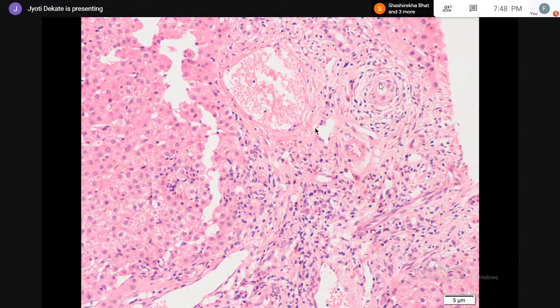We can see that this bile duct is infiltrated by some of the inflammatory cells, and also striking is this concentric lamellar edema or periductal edema, which is seen in this native duct branch. And also some of the ductular profiles, they are not so striking here, but yes, there were some ductular profiles at the interface.